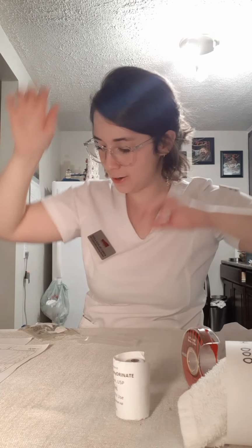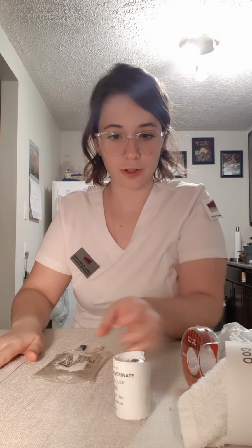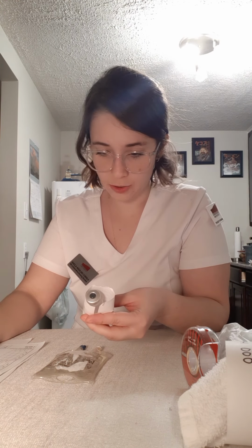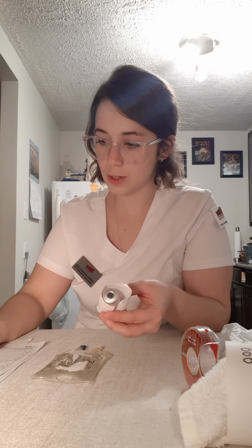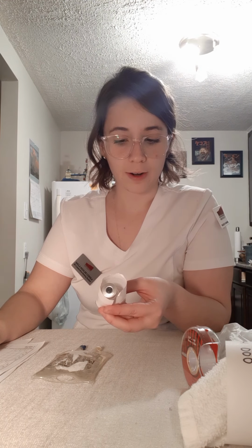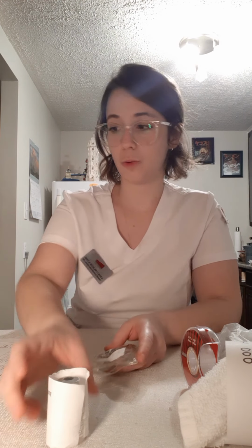Perfect. Back at it. Okay, so I'm going to mix it. Perfect. And I'm just going to make sure that I got the right medication. I'm going to do my third medication check. Okay, so it was dimenhydrinate, 50 milligrams that were in 1 milliliter, 50 milligrams for IM or IV use, that expires in November 2022, and I put that into my 50 milliliter bag of 0.9% sodium chloride injection that expires in March of 2021.